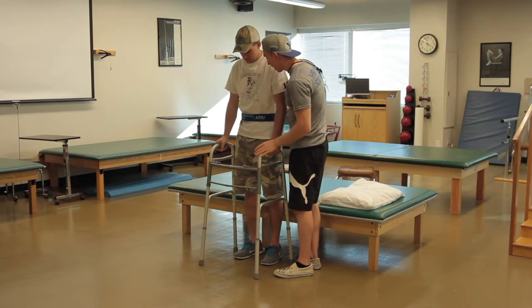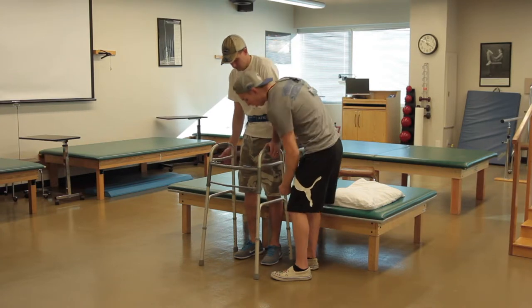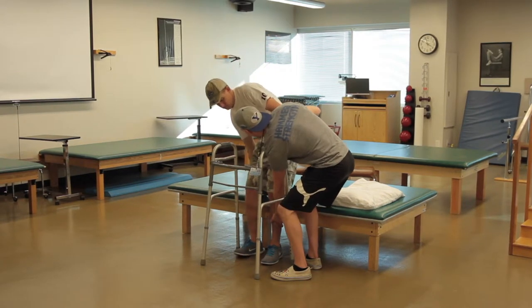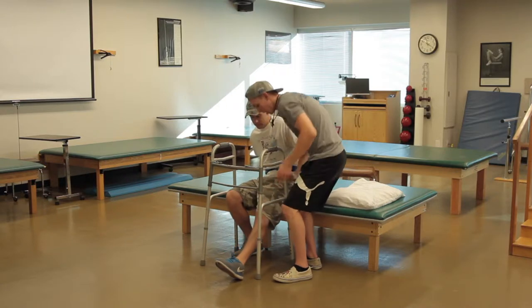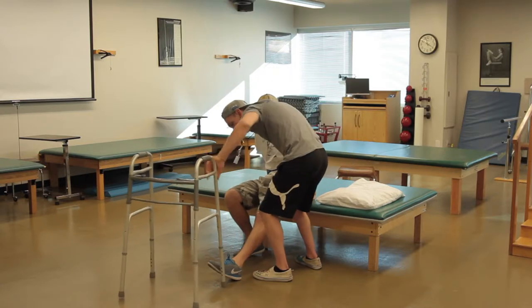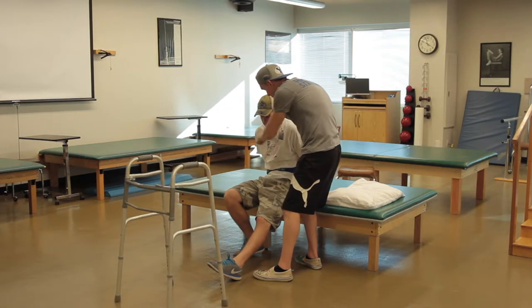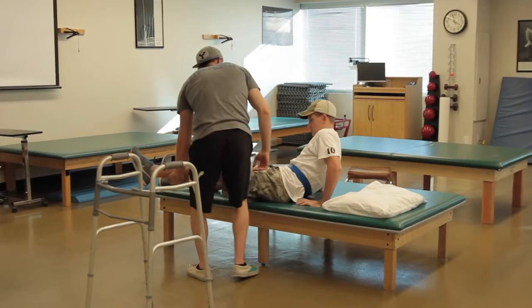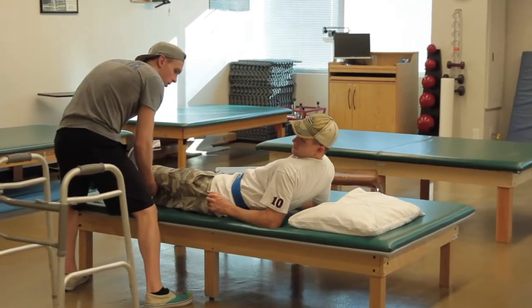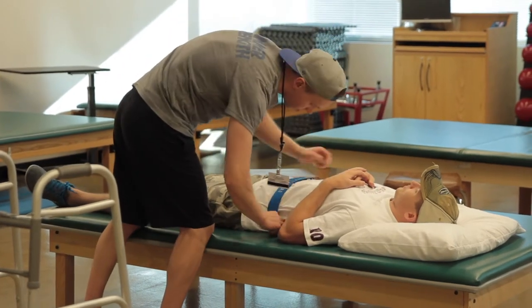Now you're going to reach back with both hands, get that table, keep this leg straight, and I'll help keep the remainder here. Good. Okay, I'll get the walker over here. Now I'm going to help with that leg, and we're going to go back onto the bed. Very good. Get this gait belt off of you.